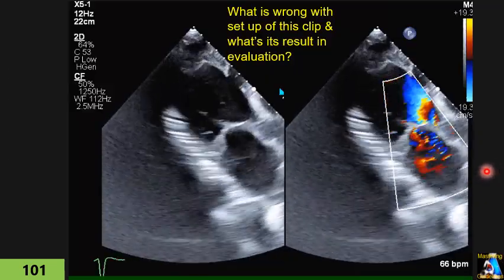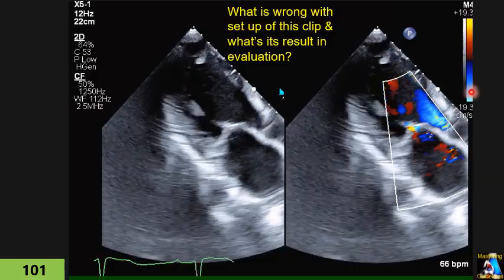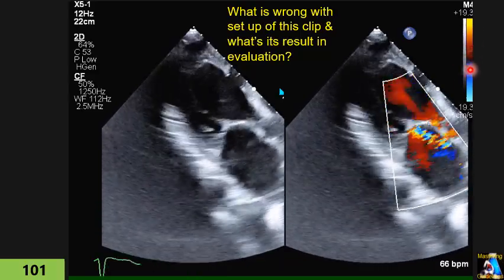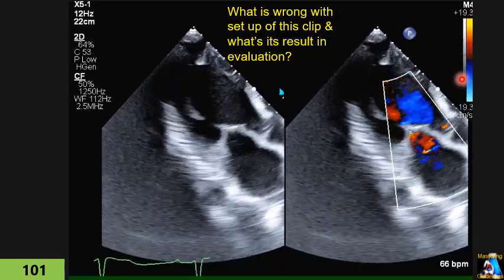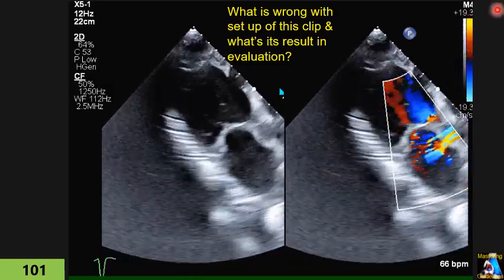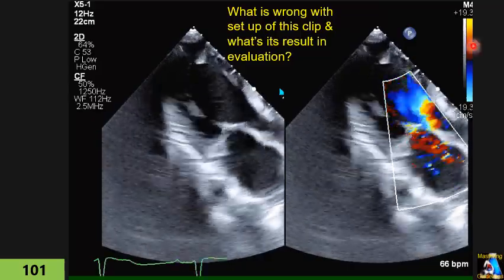Here, one of the common mistakes, not by the tech, but usually by some other tech that used the machine, is that for some reason they play with the scales. Always when you start doing an echo, your first step is to look at your scale. Sometimes your hand touches it and it changes. Here on the heart, the scale should be around 55 to 60 for an adult. Here you can see 19.